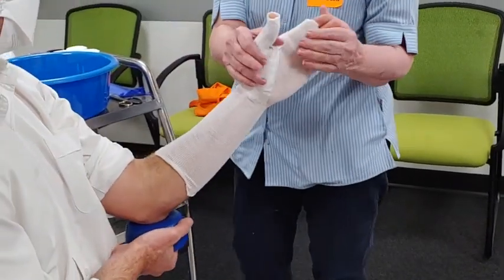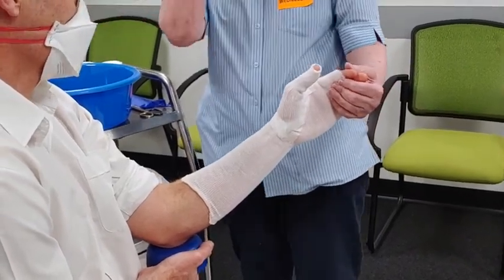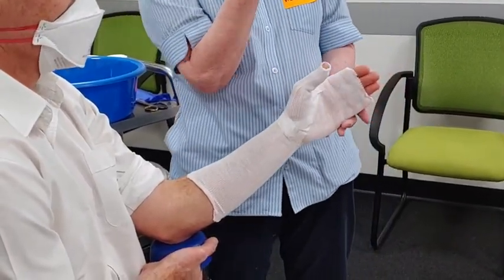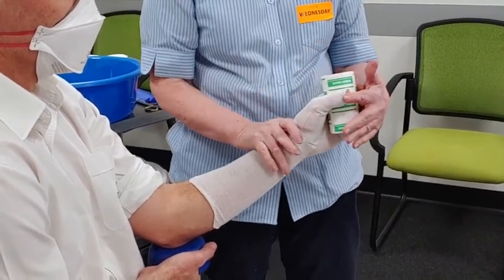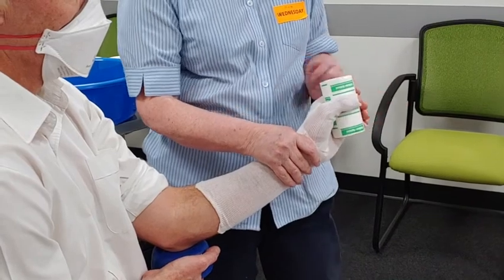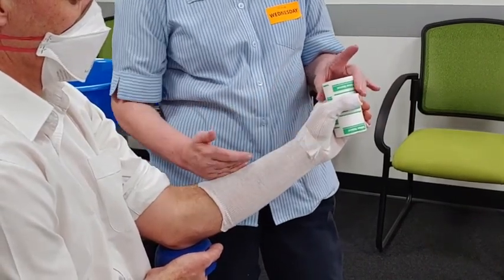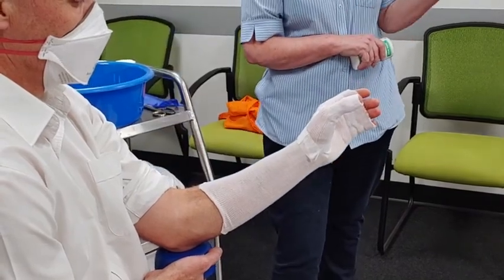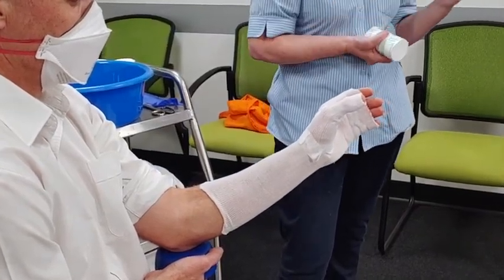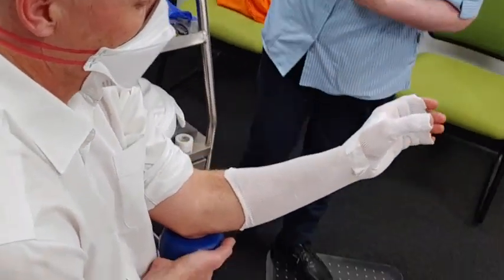Next, we want to make sure we get the position we want before we go too far. If you've got a roll of bandage or soft bandage, pop it in their hand and cock their wrist back — that's a true scaphoid position. You've lined the thumb up straight down the radial part; slide it out and that's the position you want. You can have neutral — it just depends on your consultant. They might want it left in neutral, but that is the true scaphoid position.